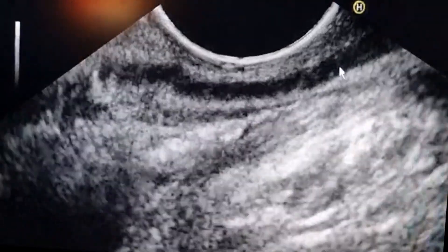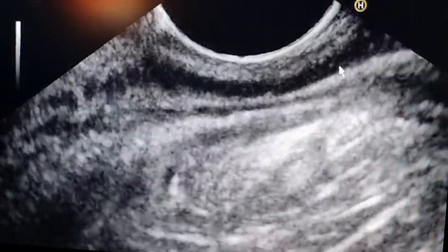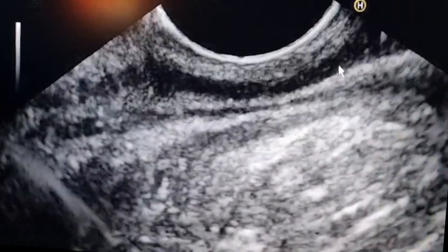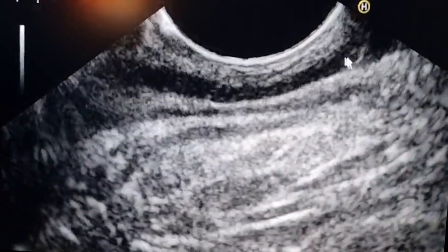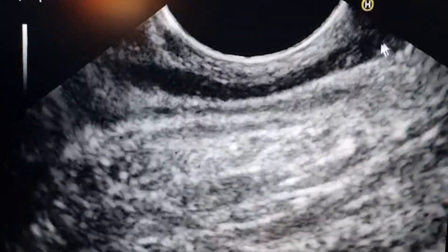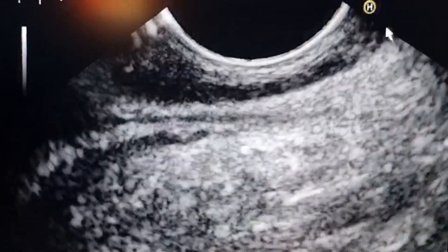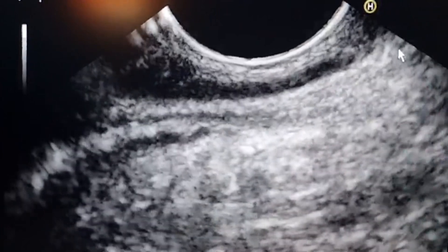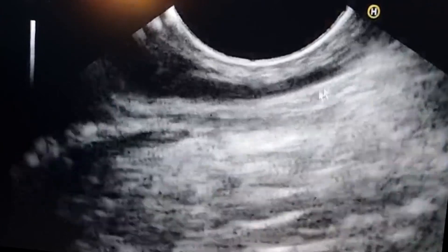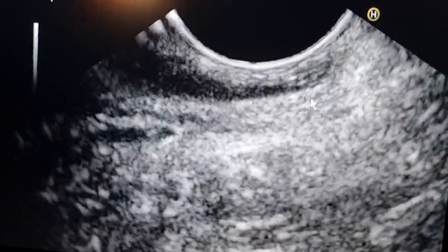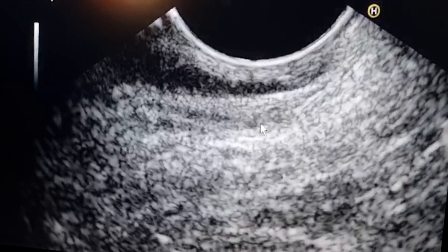This is the internal anal sphincter, and the internal anal sphincter will end at the distal third of the anal canal, and only the external anal sphincter is there. This is the internal anal sphincter — it ends here. And the rest is the external anal sphincter, the intersphincteric area, and below is the external anal sphincter: the deep and the superficial part.